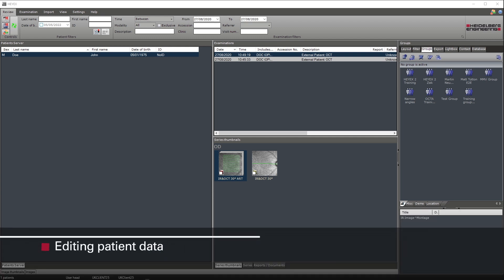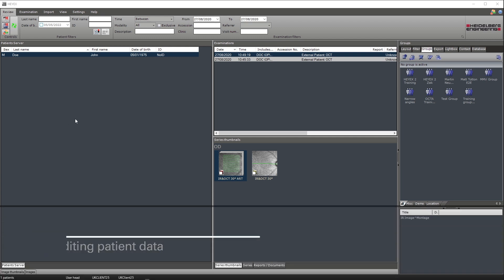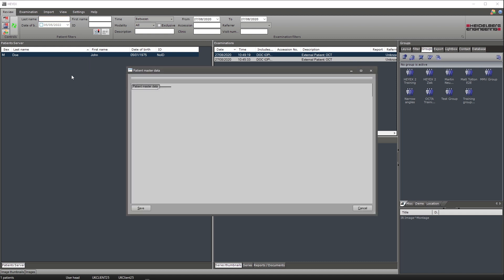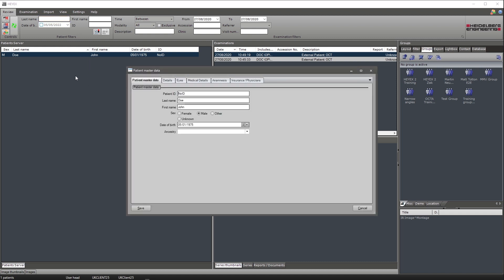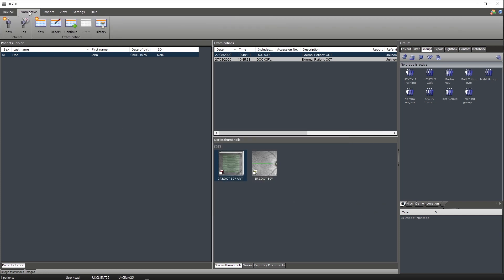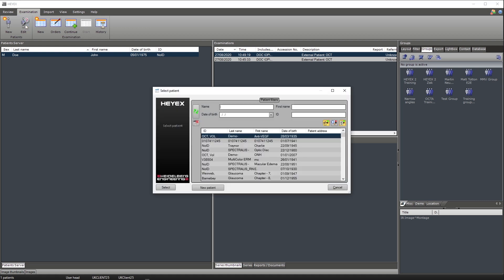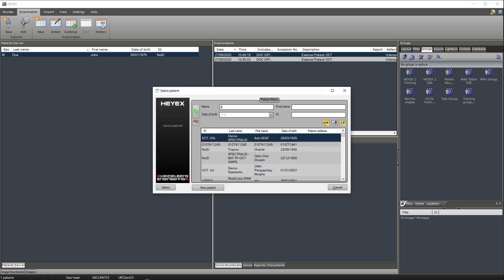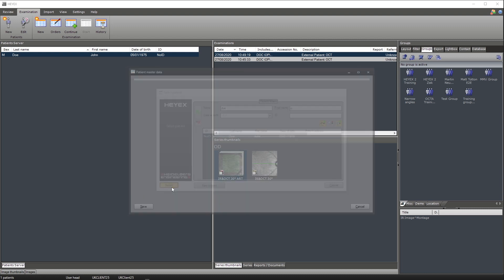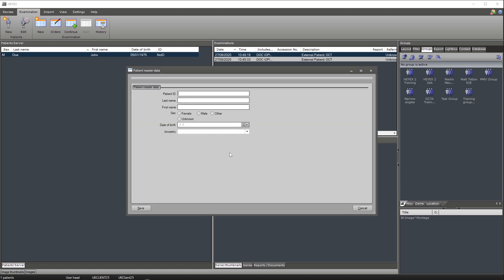To edit patient data, there are one or two ways to do this. By right clicking the patient required within the patient server and selecting rename patient, this is where you can change the patient master data. Secondly, by clicking on the examination tab within the ribbon bar and selecting edit. Here is where you can search for a specific patient to then click select to edit the patient data.